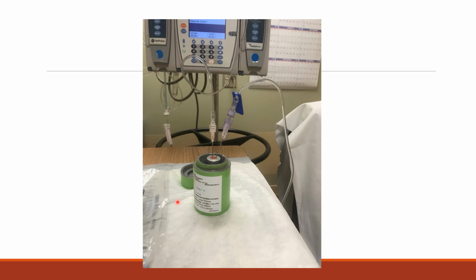I actually took this picture. This patient was very nice to let me take pictures. But this is how it goes down. Short needle, long needle going to the patient. Couple things with this gravity method.